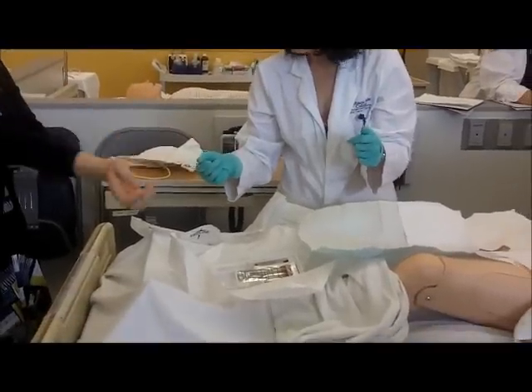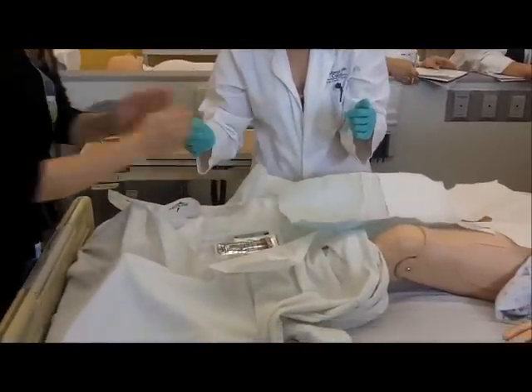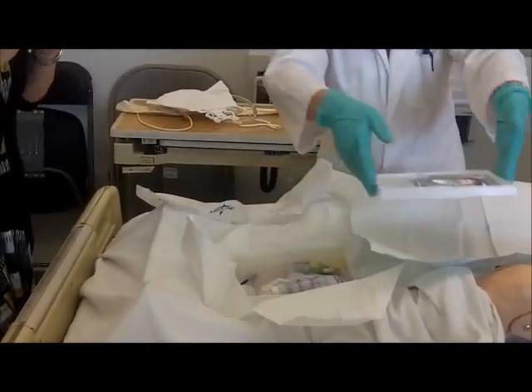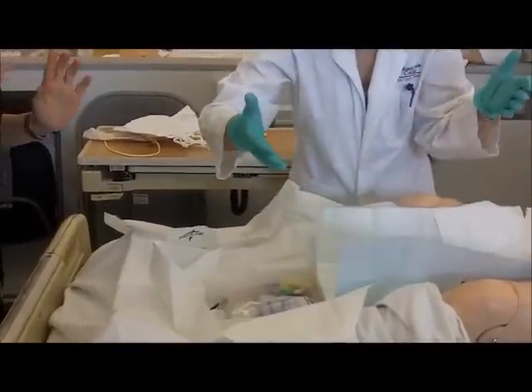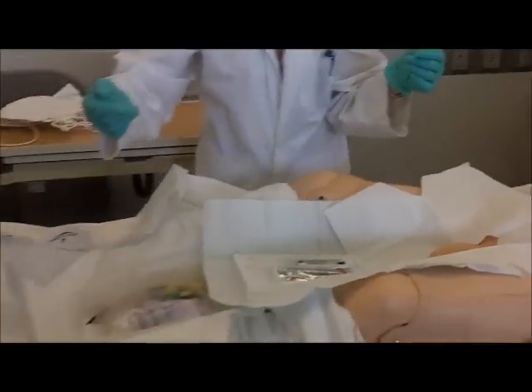Now what are you going to do next? What I would do next is I would lift this out and place it right there. Lift the plastic out and place it a little closer. Drop it right there. Your hands are sterile, right? Yes. So now there's a couple of things that you need to do — you need to open. Both hands are sterile, so you're still good. And now you're just contaminated and you just failed.